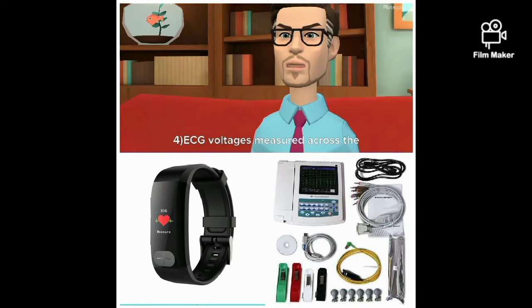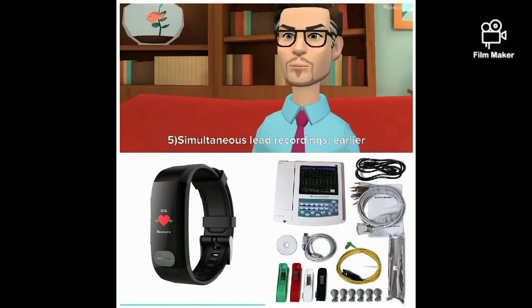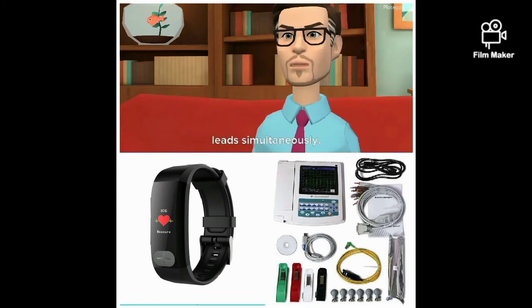4. ECG voltages measured across the body are very small. This low voltage necessitates a low noise circuit, instrumentation amplifiers, and electromagnetic shielding. 5. Simultaneous lead recordings. Earlier designs recorded each lead sequentially, but current models record multiple leads simultaneously.